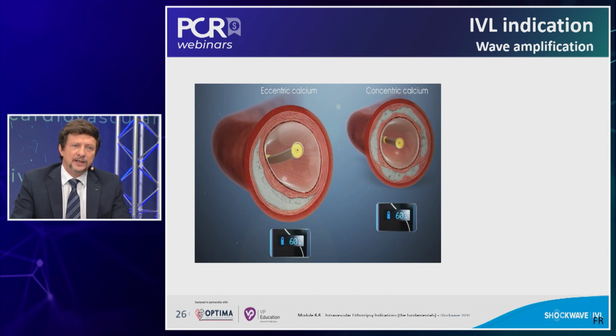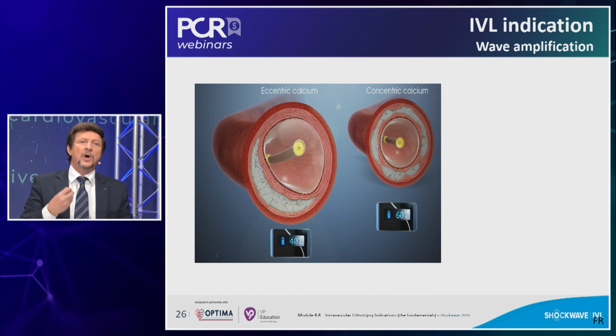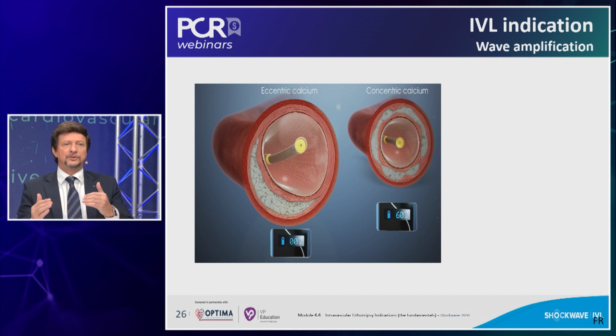On the left side, what you see is that after 60 pulses, you still don't have enough microfractures. We don't know. There is no diagnostic tool to know whether you have done enough microfractures or not, because these microfractures cannot be seen by angio, nor by IVUS or OCT. You need micro-OCT or autopsies. So what we advise is that in the case that we have presented today, where the distribution is so uneven and deep, you should be patient and use all your pulses until you are done.